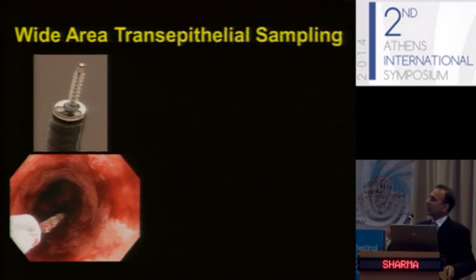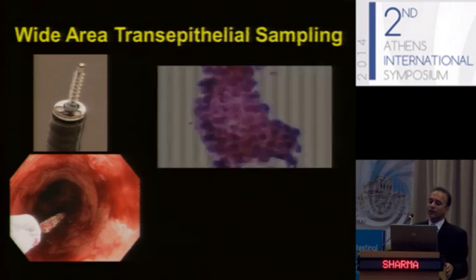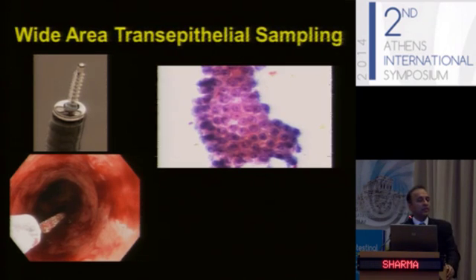The important thing, what helps improve the diagnosis of dysplasia here, is that they use an artificial neural network computer. The computer looks at all the brushings and then presents to the cytopathologist the 200 most abnormal cells by using a complicated algorithm which was actually developed by the Israeli army to look at the pictures from the drones to see what was true enemy versus pseudo enemy, and that's exactly how this artificial neural network is used.